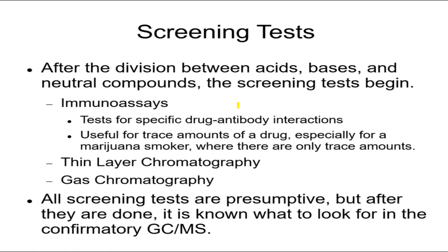I mean, let's say a cat, a mouse, a rat. We use rabbits mostly, but you put a drug in there, the body's going to try to fight it off, and it'll develop antibodies to cling to this drug and hopefully destroy it or enable it to drag it out so it'll be flushed out of the system. So your body finds the drug, it develops an antibody that'll stick to this drug specifically. So if you can get an antibody that sticks to this drug specifically, you mix this suspected sample with the antibody. If you see it sticking to it and clinging to it and making a cloudy solution or a darker solution, then you know it's that drug.